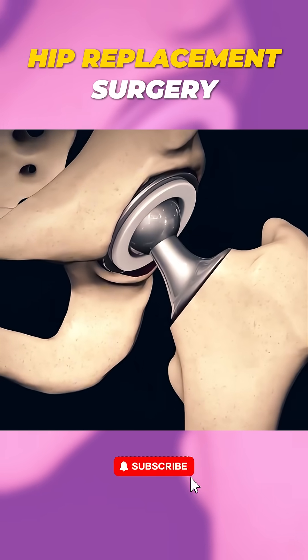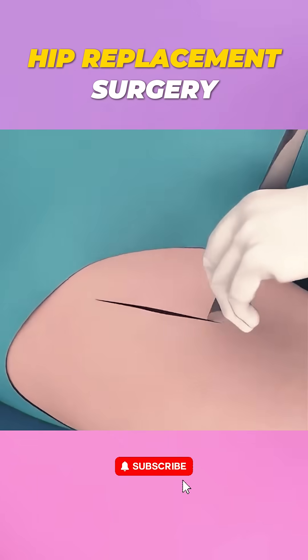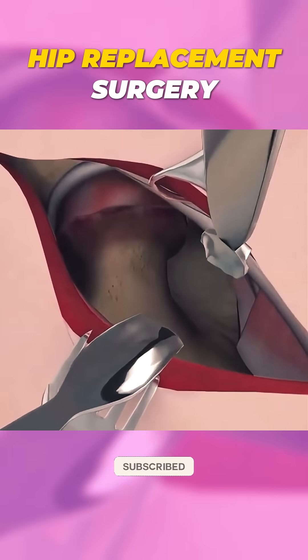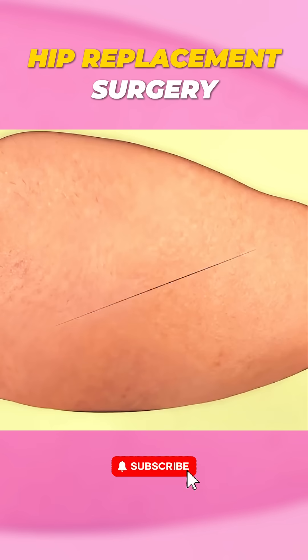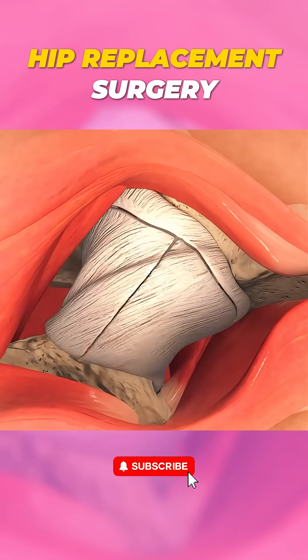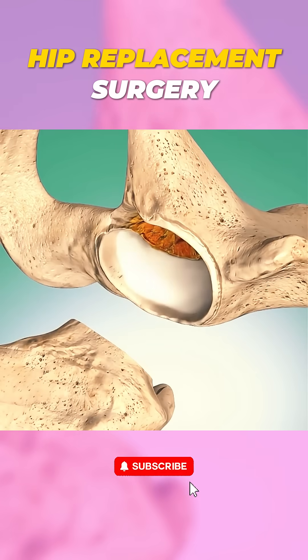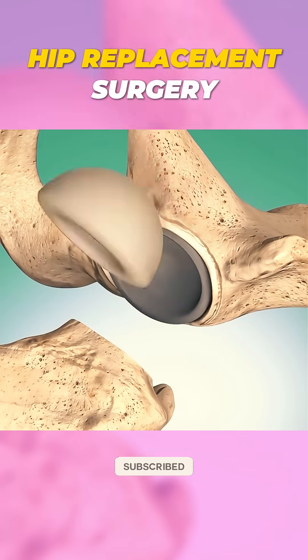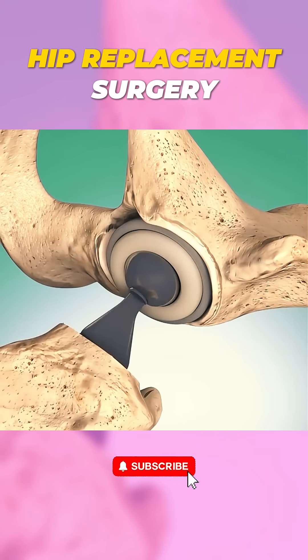Anterior hip replacement involves replacing the damaged joint from the front of the hip, not the side. During the surgery, the patient is positioned on their back. The surgeon makes a small incision on the front of the hip, right over the muscles, which means no cutting through large muscle groups. The surgeon carefully removes the damaged ball and socket of the hip joint and replaces them with a prosthetic, which is usually made of metal and plastic.